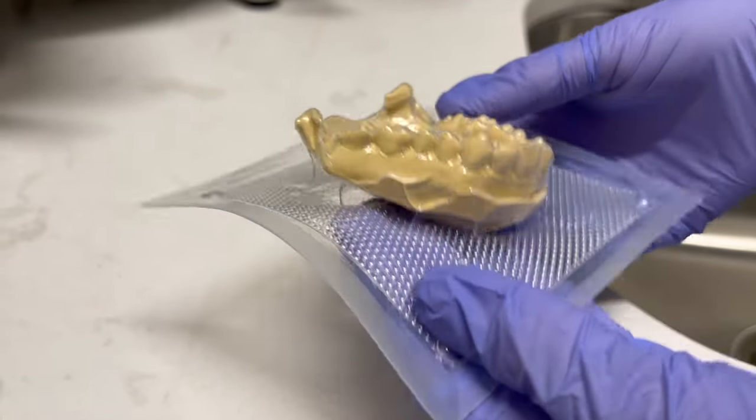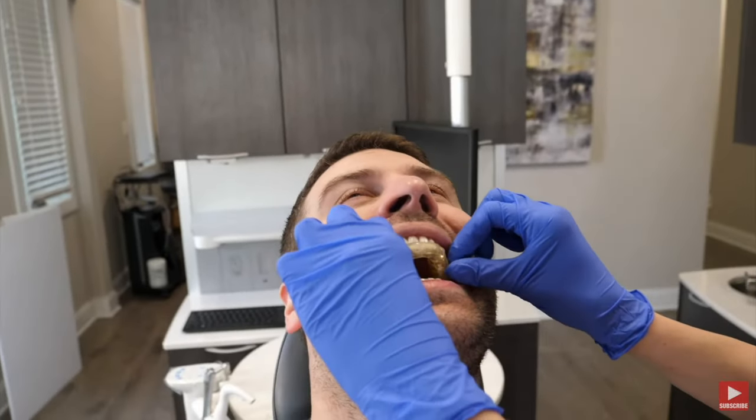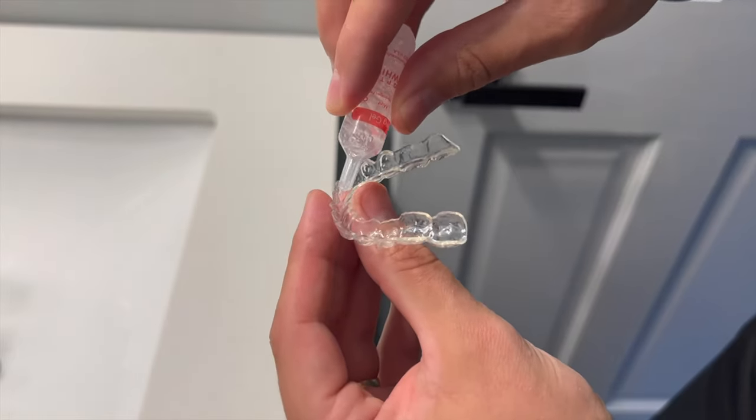Then you'll come back and pick it up. They will confirm it fits in your mouth and give you instructions on how to use your whitening trays at home.